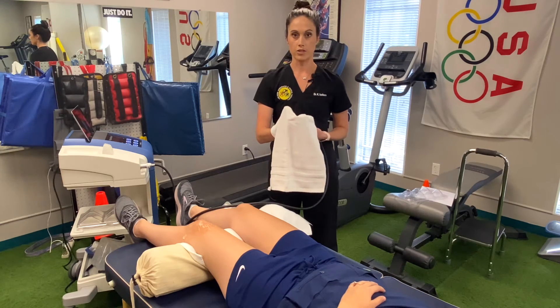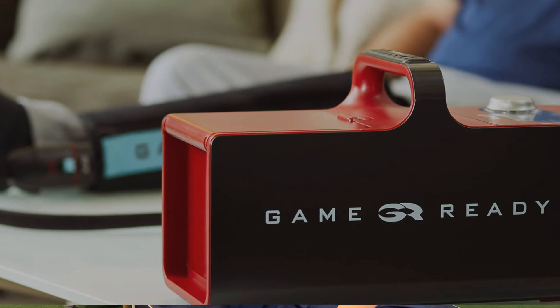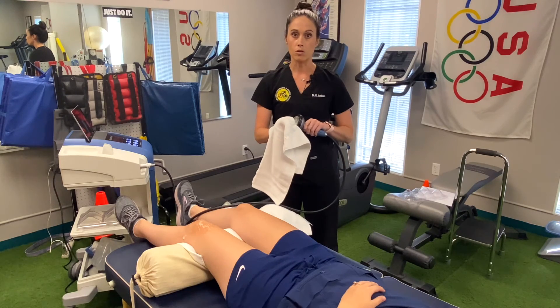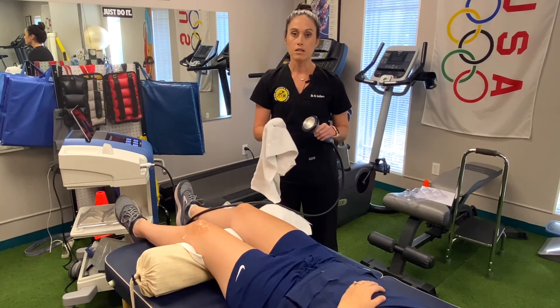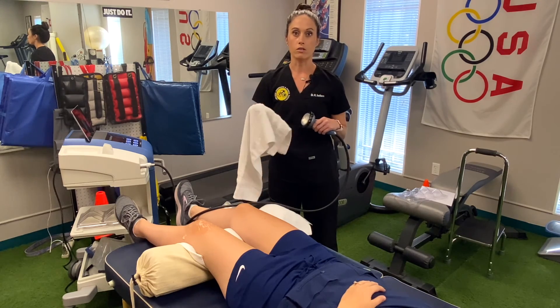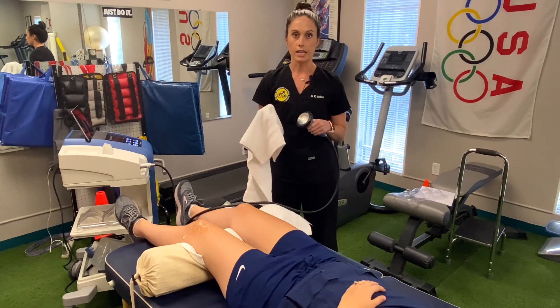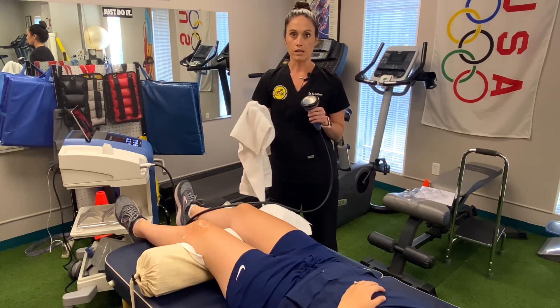Typically after a treatment session with the PisaWave, we put the patient on a machine called GameReady. GameReady is ice compression — there is a sleeve specific for each body part, and that sleeve will compress while pumping ice water through it at the same time. So you're getting that compression and ice factor together. We really like to couple that with the PisaWave.